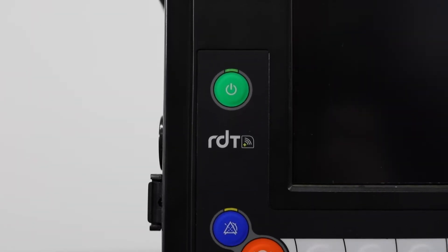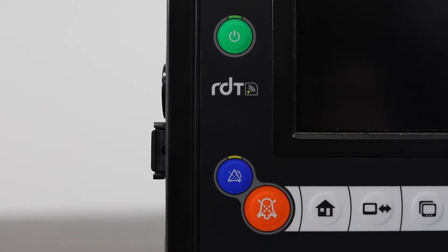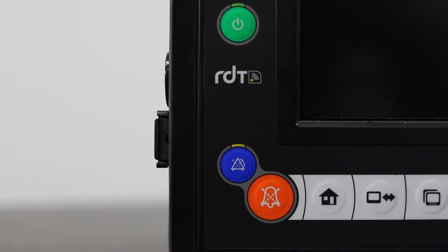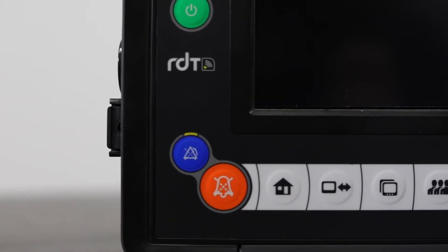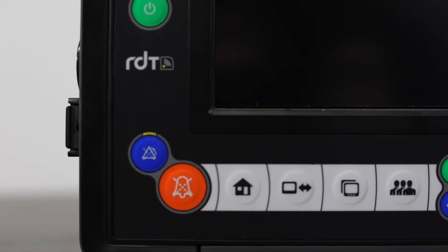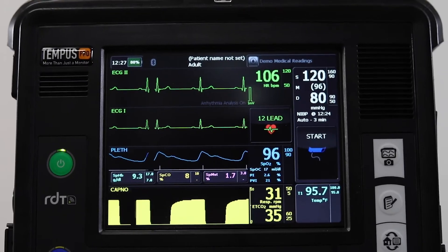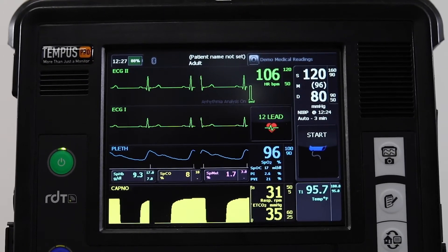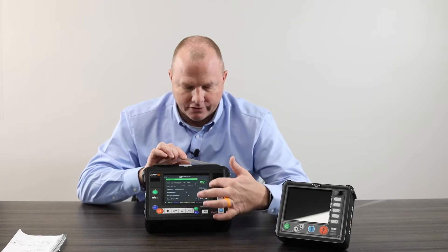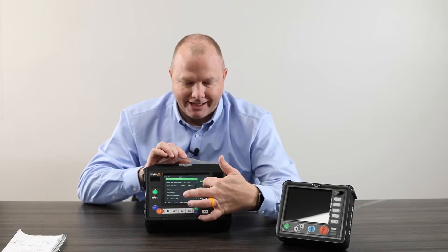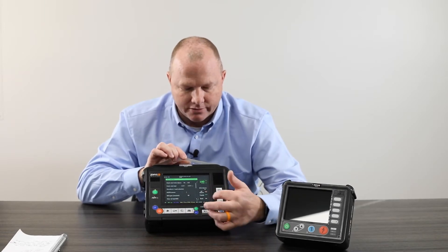Just a quick overview on a 360 of the Tempus Pro unit. On the face, it's a full functioning touch screen. Any parameter you can just touch into that area of the monitor and make any adjustments or modifications that you need to.